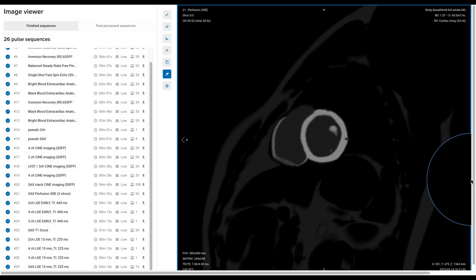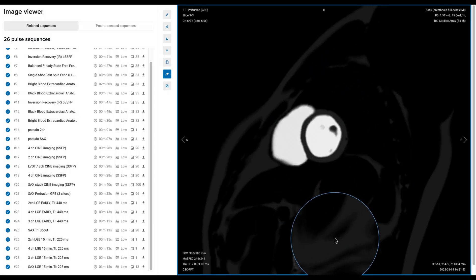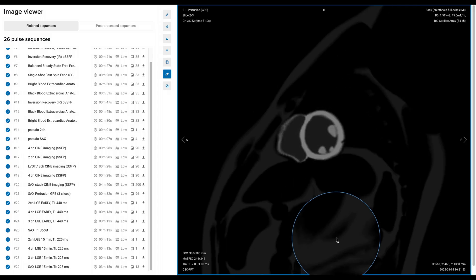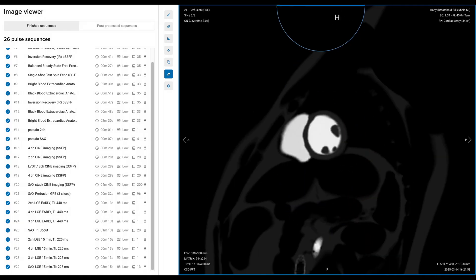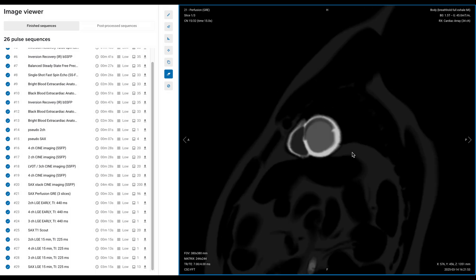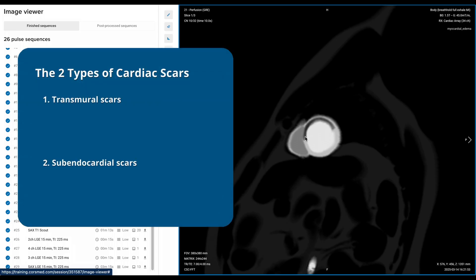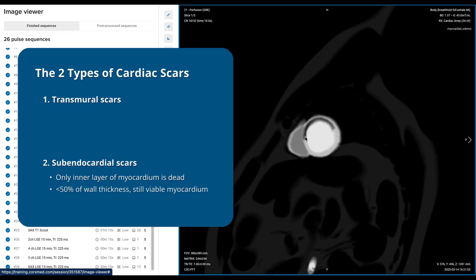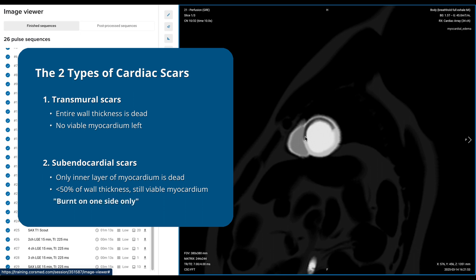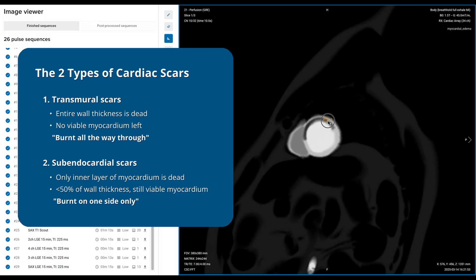You should watch the perfusion video as many times as you need to understand the contrast pathway — how the contrast travels through the heart. It goes from the right side to the left side, not the opposite. This may seem obvious, but it's really important to understand this pathway to time your sequences after contrast. Here's where we have our perfusion defect. Now we can determine if the scar is transmural or subendocardial. Subendocardial means that only the inner layer of myocardium is dead — these scars involve less than 50% of the wall thickness, so there's still viable tissue that might recover. Transmural scars means the entire wall thickness is dead tissue with no viable myocardium left. In this case it's subendocardial, because the scar only goes up to a certain point.